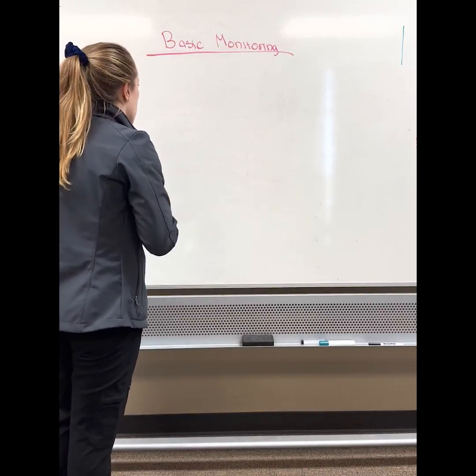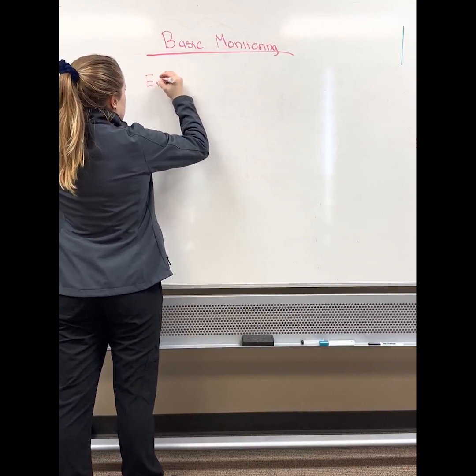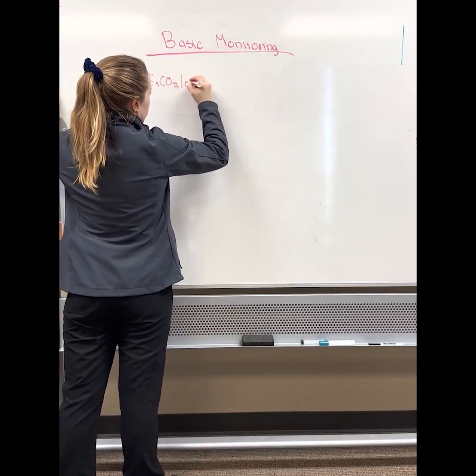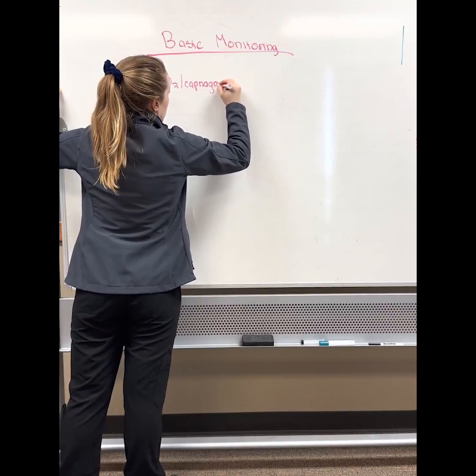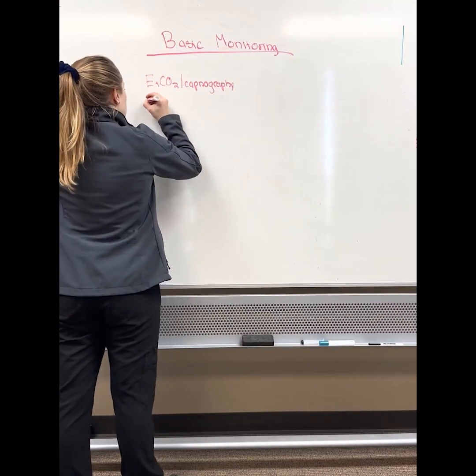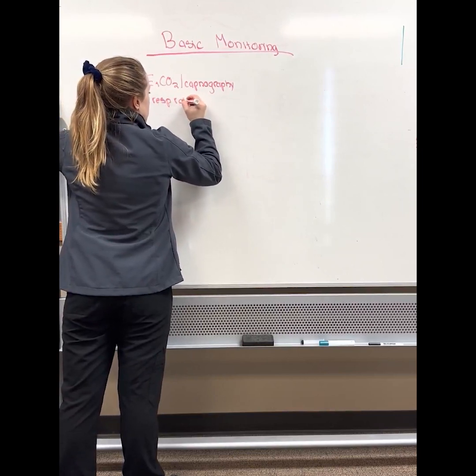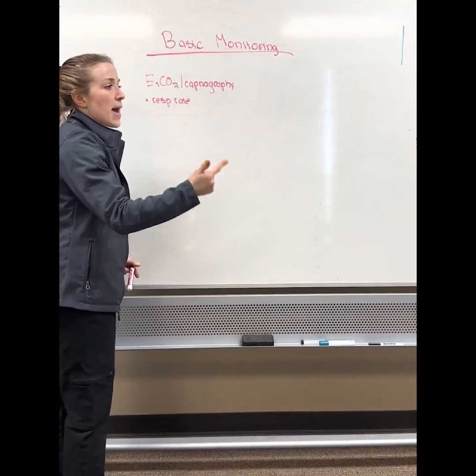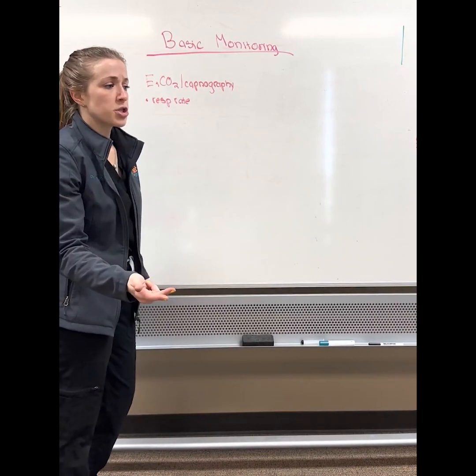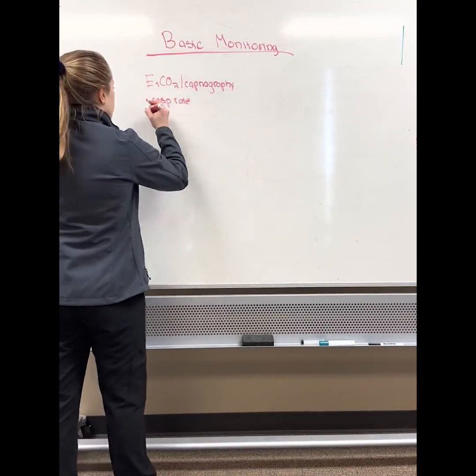The next thing I want to talk about is end-tidal CO2 or capnography. ETCO2, capnography. Okay. So capnography tells you about respiratory rate, which can tell you all types of things: comfort level, temperature, response to surgical stimulus, certain types of lung diseases.